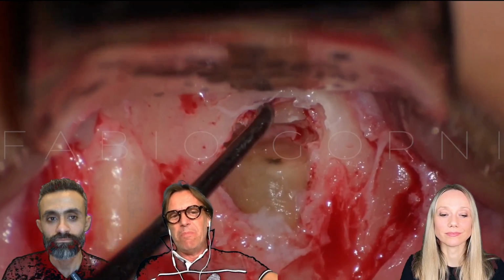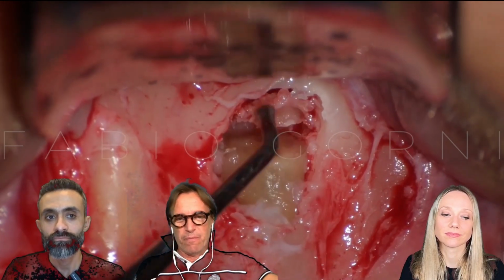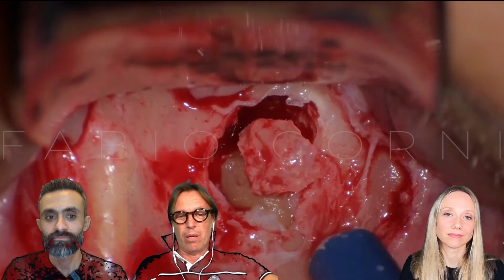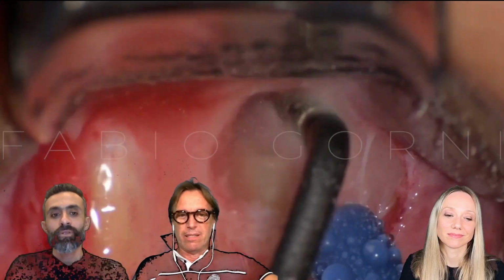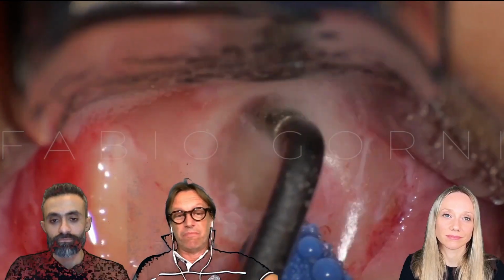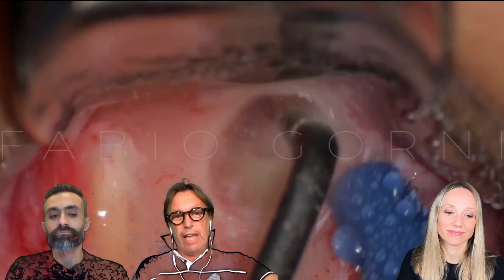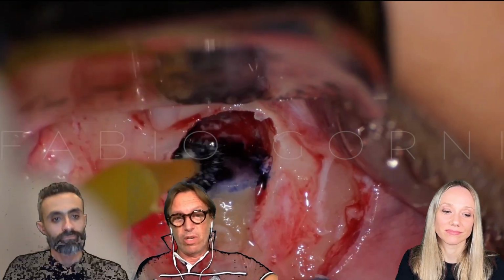In my career, I immediately started with the straight handpiece, because I learned endodontic surgery in Boston from Melvin Harris, and Melvin used the straight handpiece. So for me, it's not so strange. But I know that many people are using the angulated handpieces, but in my opinion it's nonsense, because it's so important to check everything. And also in the video, you can see everything because I'm using the straight handpiece.